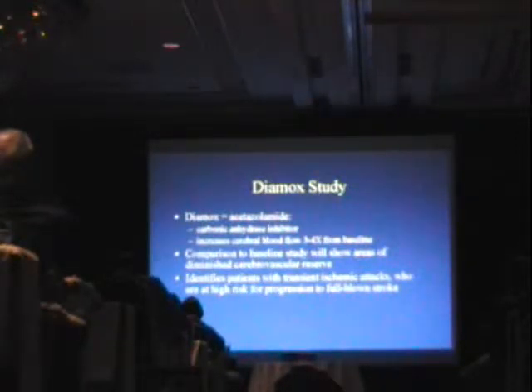This is just like you do with myocardial imaging, which Dr. Carley will talk about in a minute. There you identify areas of ischemia. Here we call it diminished cerebral vascular reserve. So for these patients, particularly patients with TIAs or patients that have had a stroke, it can show that they may re-stroke, they have another area that may have a stroke, or patients with TIAs may have an impending stroke in this area of the brain.